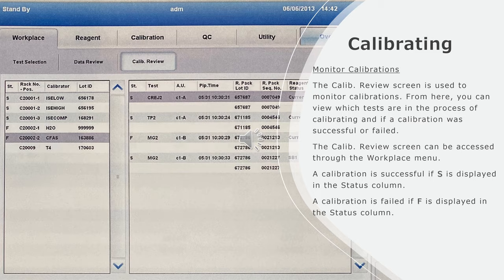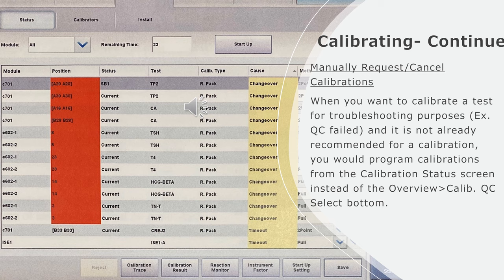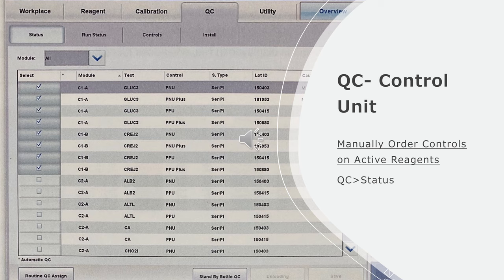Manually request or cancel calibrations: When you want to calibrate a test for troubleshooting purposes, for example QC failed and it's not already recommended for calibration, you would program calibrations from the calibration status screen instead of the overview and then calibration QC select button.